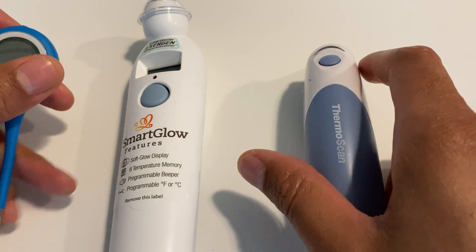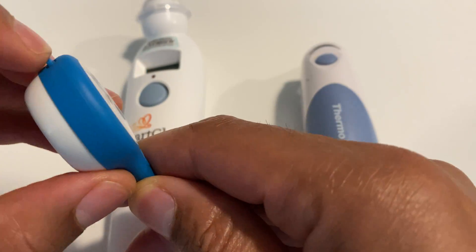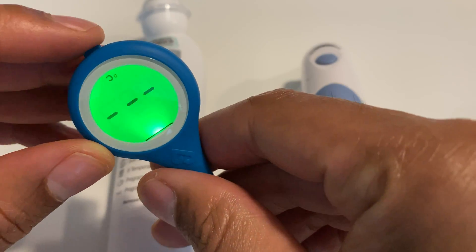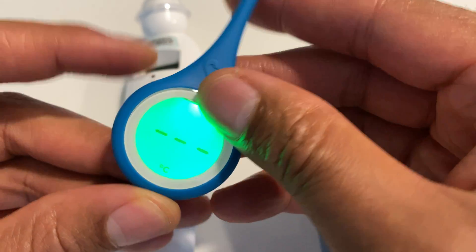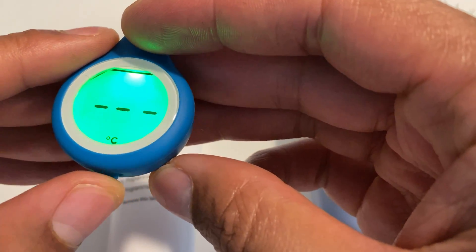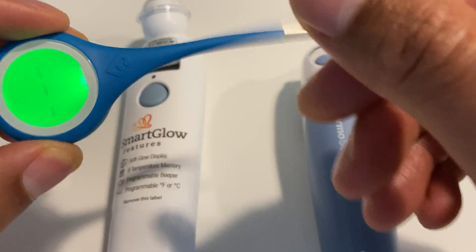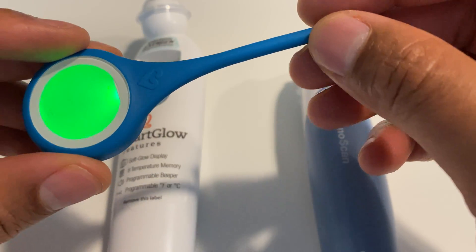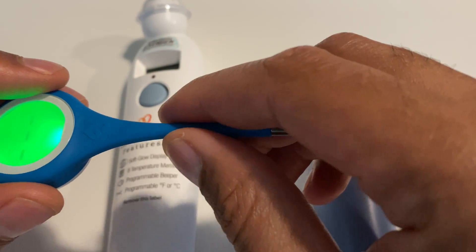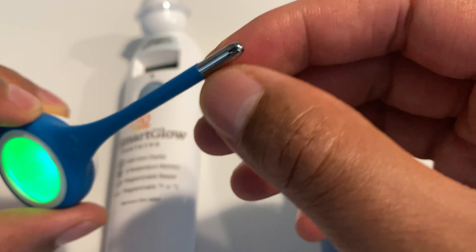Starting with the Kenza Quick Care thermometer — this is a fairly small thermometer with only one button to press. It currently is in Celsius mode, but you can flip it to Fahrenheit by pressing and holding this button. The directions are fairly simple. It's small — you can fit this into a pocket or carry it in your purse. There's a probe here that is used for taking the temperature.